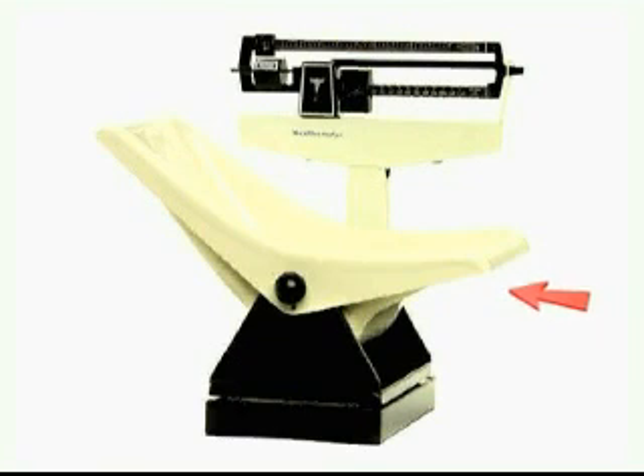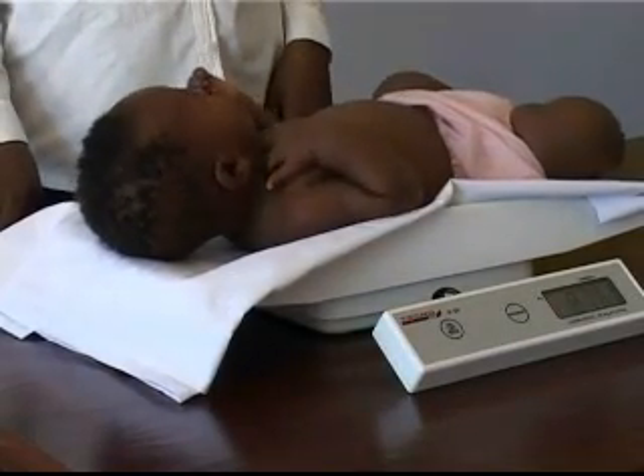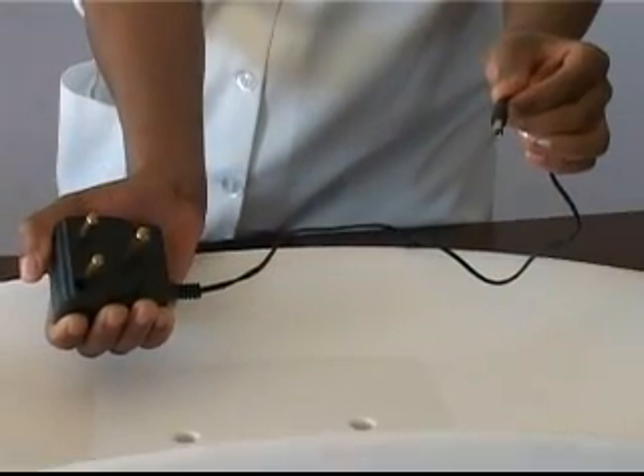The basin type tabletop model is a double beam with a sliding scale in metric. The weighing range is 0 to 16 kg, with 10 g graduations. It has a shallow tray and is only suitable for babies. The basin type tabletop model is also available as an electronic model with a shallow tray, operating on battery or mains supply.